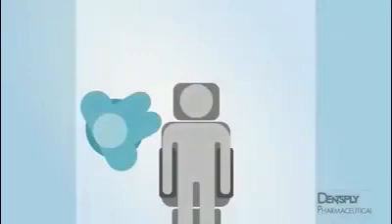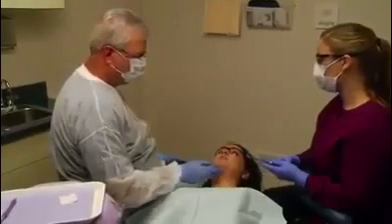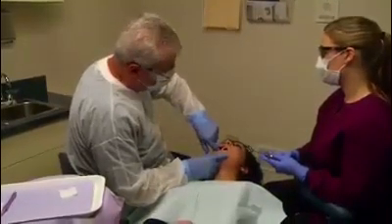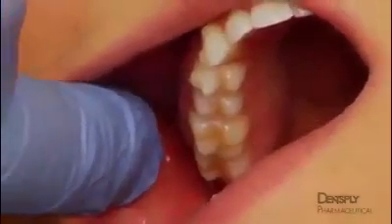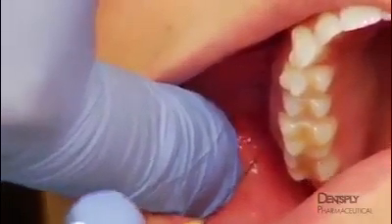The 8 o'clock position may be used for the right high tuberosity block, and the 11 o'clock position may be used for the left. The patient's neck is extended and the head turned to permit visualization of the buccal vestibule. A finger is used to palpate the zygomatic process. The mouth is partially closed and the jaw is shifted toward the side of injection. With the palpating finger placed over the zygomatic buttress, the needle is carefully moved into position.